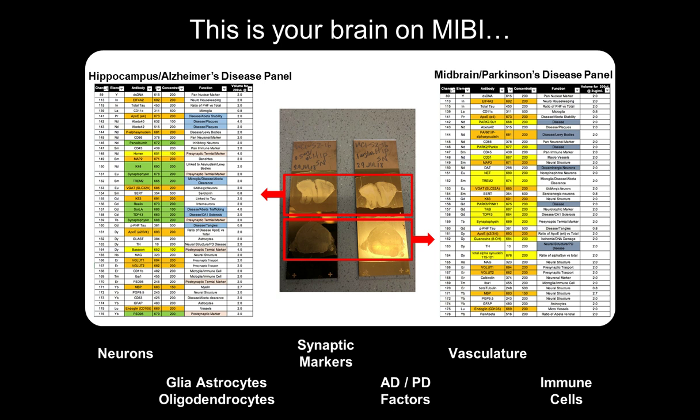So how did we put this together? This has been a bit of an odyssey in the lab. We have a really great team of staff scientists, graduate students, and postdocs working on this. The goal here, and you don't need to memorize these panels, is that we've spent a lot of time trying to screen and validate FFPE qualified neuropathology antibodies for use in multiplexed assays. We've put together two panels to target Alzheimer's disease versus Parkinson's disease. These two panels aren't unique; there are just over 50 unique markers between the two panels, with quite a bit of overlap.